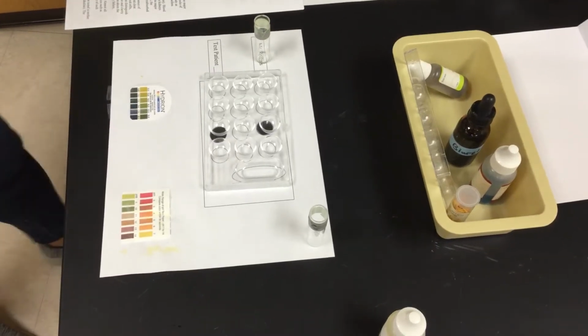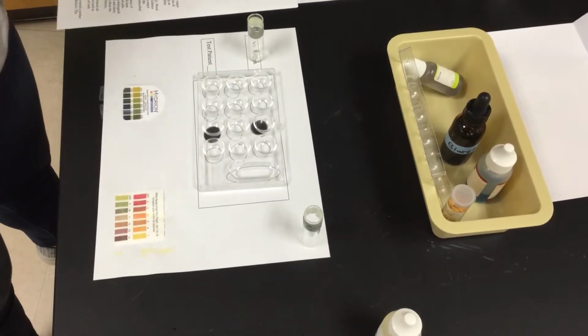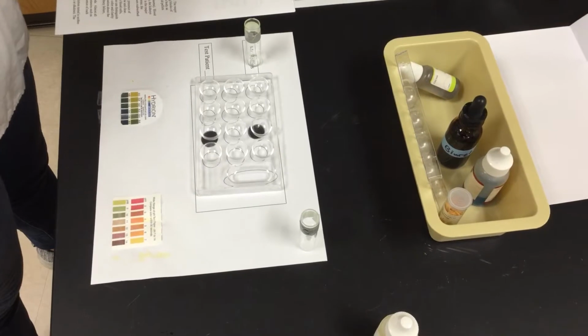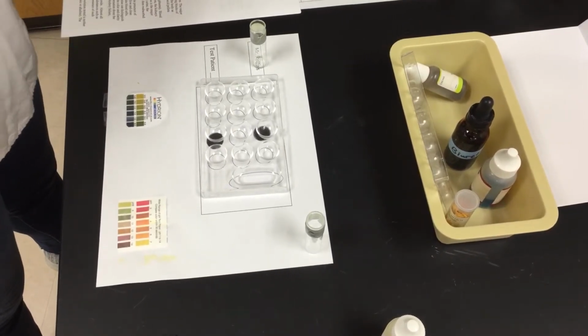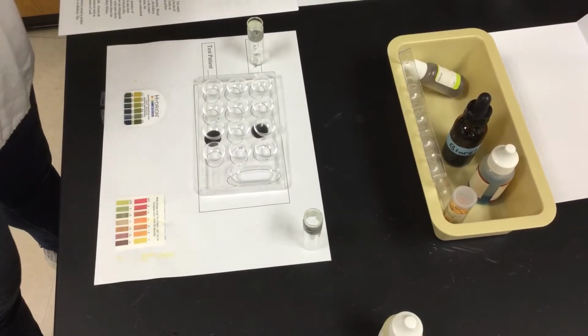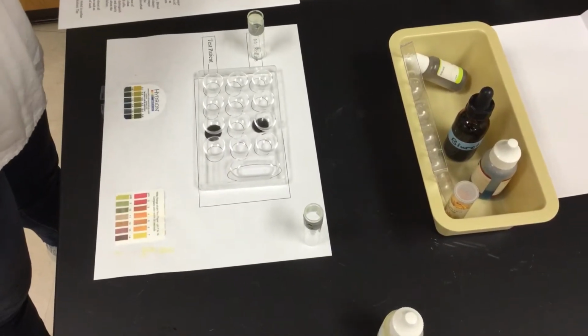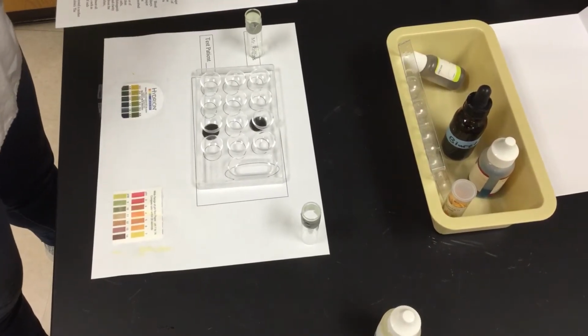All right, so the lab we're doing this week is going to be for urine analysis. This is kind of similar to what you may have done in first year bio, where you tested foods for different organic macromolecules, glucose or proteins or lipids and things like that. So sort of the same chemicals will be seen. You will be testing for proteins. You will be testing for sugars, but now you're going to test for something called chlorides instead of lipids. We're also going to be looking at pH.